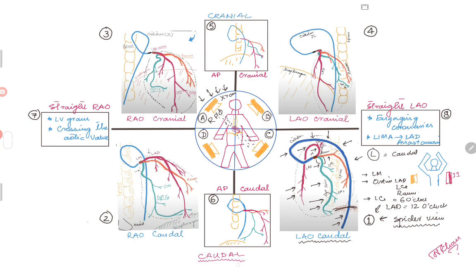Moving on to picture two: to recognize the image, look at the catheter shown in blue. It's coming below the diaphragm, so probably femoral access. It's a JL or Judkins left catheter, and here the catheter is folded on itself and retracted, so it's probably an RAO view. Since you see the diaphragm just in the corner and not in the middle of the screen, it's probably a caudal view — exactly the RAO caudal view we will be discussing.